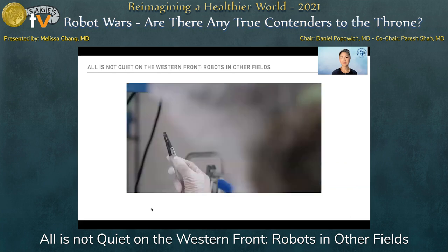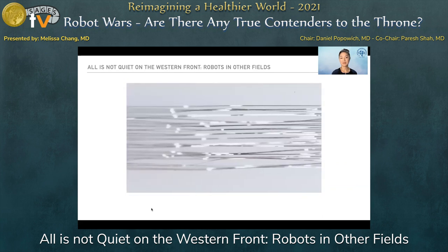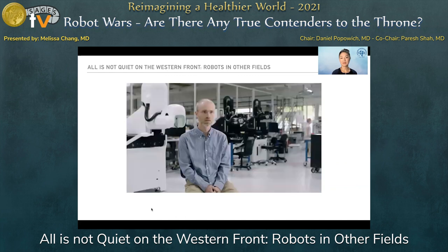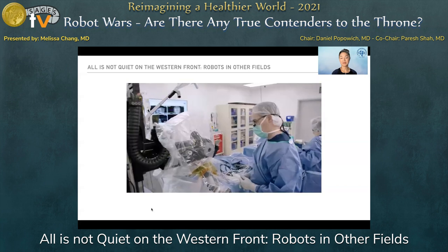In order to do that, the devices are extremely fragile. The threads that we insert that contain the electrodes are tiny, sort of on the order of like 50 microns wide, 5 microns thick, 20 millimeters long. So if you take one of them and sort of toss it into the air, it'll sort of float off like a piece of hair. And those tiny little flexible hairs are too small for a human to handle, even like with tweezers, and that's where the robot comes in.